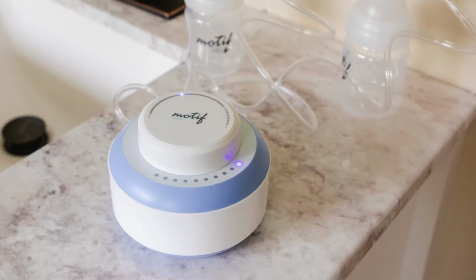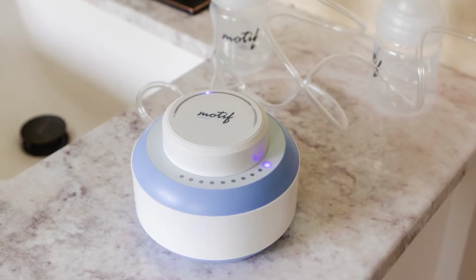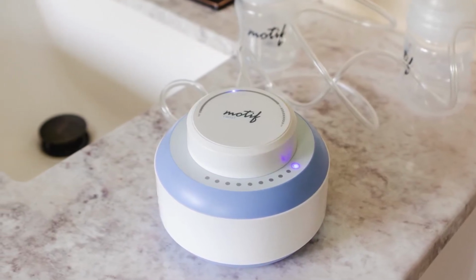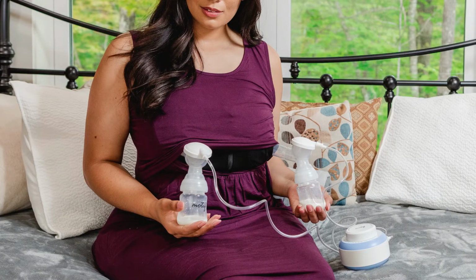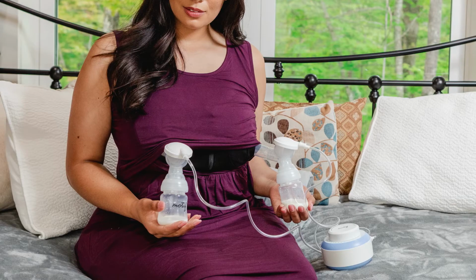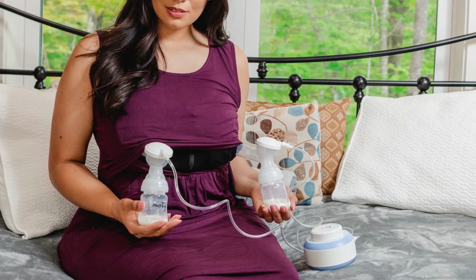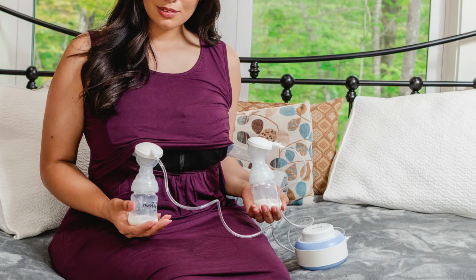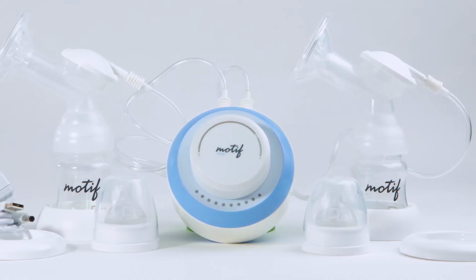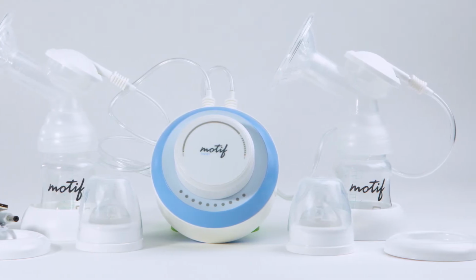Before assembling the Motif Twist, consult the user manual and follow instructions on how to properly sanitize and sterilize the pump parts before starting the assembly process. Next, be sure to measure and find the breast shield that best fits you. You can refer to the user manual to learn how to measure and find the best fit. Once you have ensured you have all the necessary breast pump parts and selected your proper breast shield, you are ready to assemble the Motif Twist.